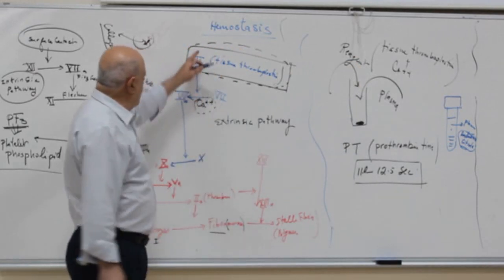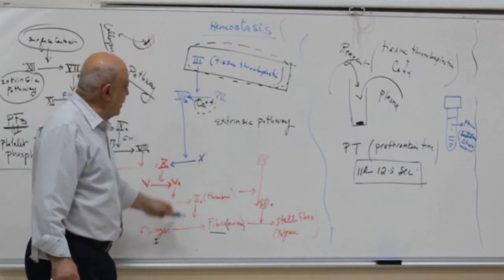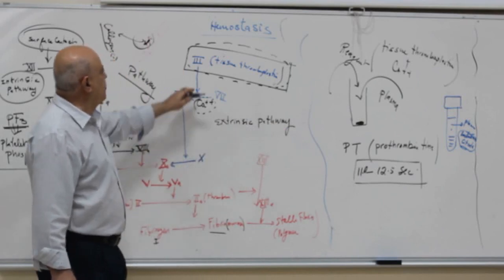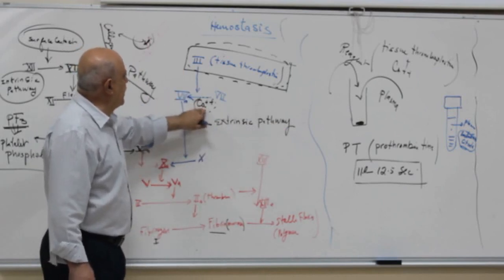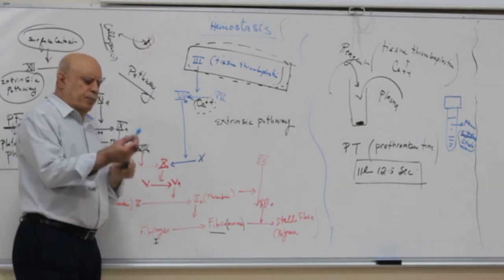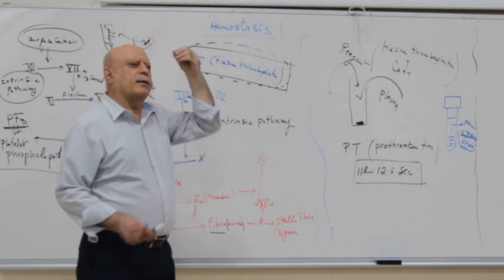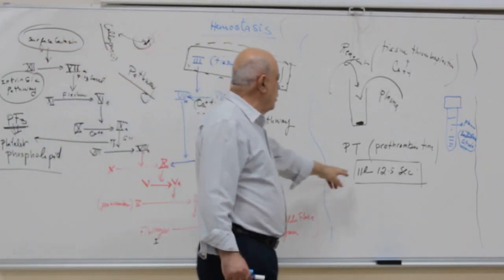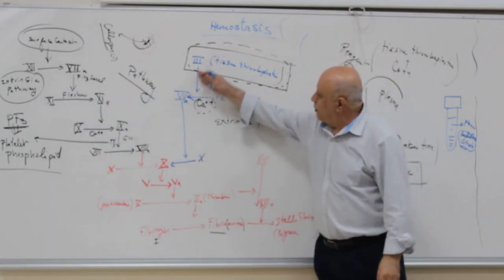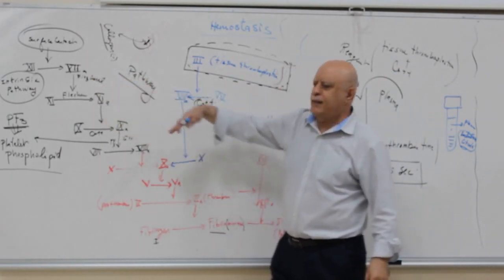So in order for this, one more time, to clot according to this pathway, all we have to do is take the plasma, add the calcium, add the tissue thromboplastin, and we should observe a clot in the test tube within 11 to 12 seconds. If every clotting factor here is normal, not talking about these, this has a different test called PTT.